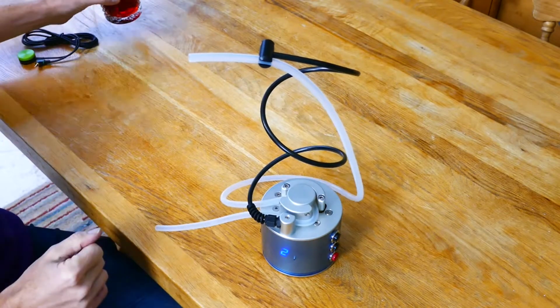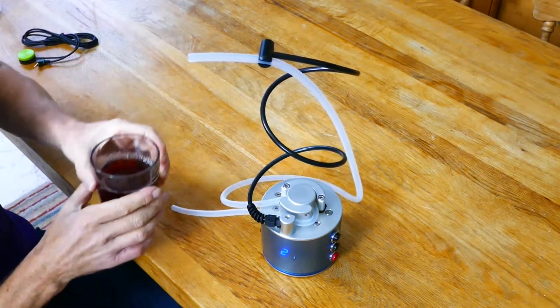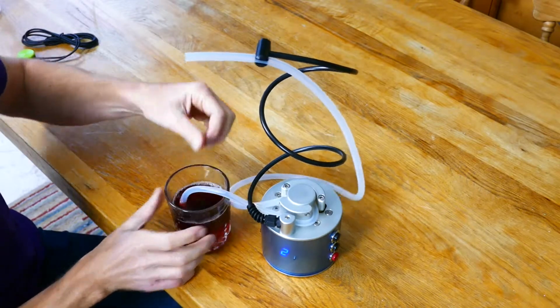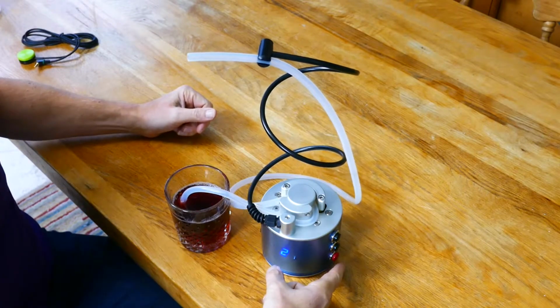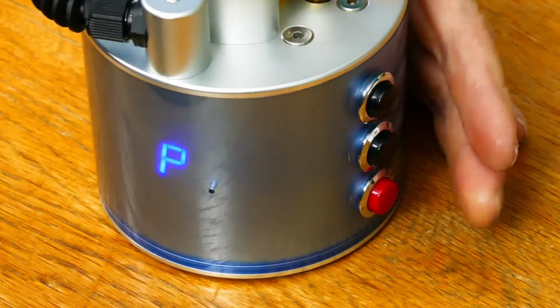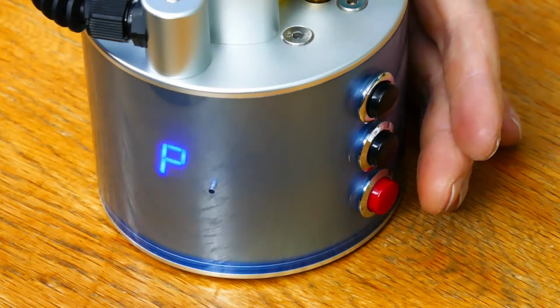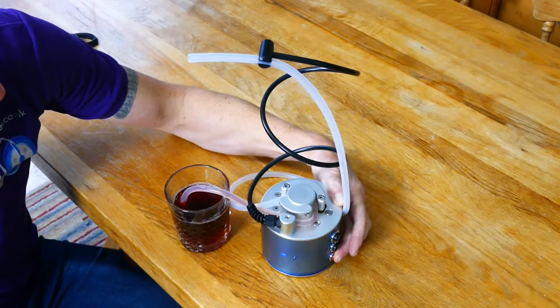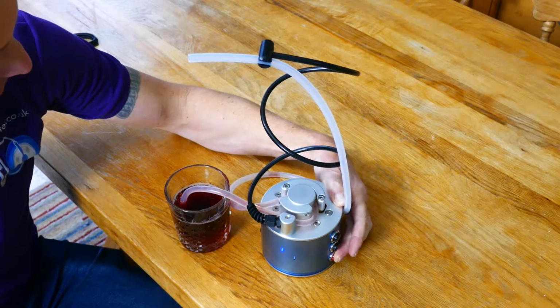And then I'm going to need to prime the straw to get the drink to the top. So the straw is going to go into the drink, and on the right hand side here there's a red button. Press the button and you'll see a P appears. I'm going to let go, and the P is solid. I'm going to press and hold it. Now if we watch, we can see the drink moving all the way up the straw.